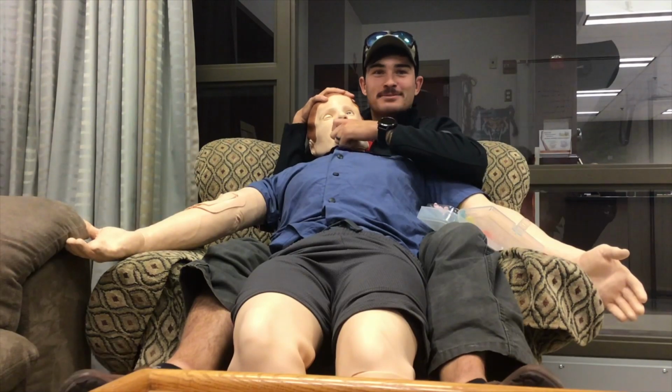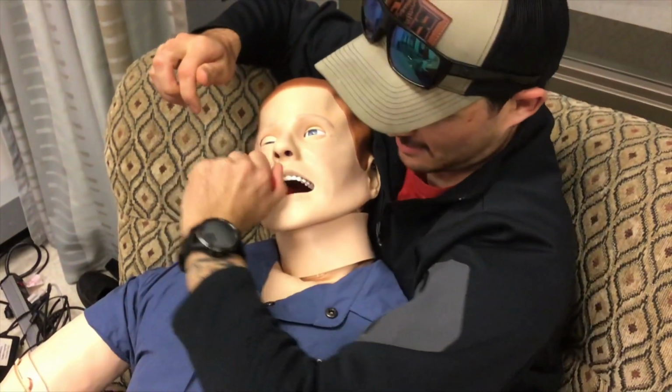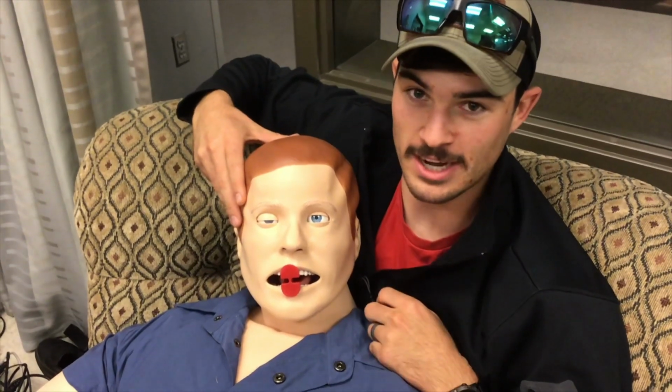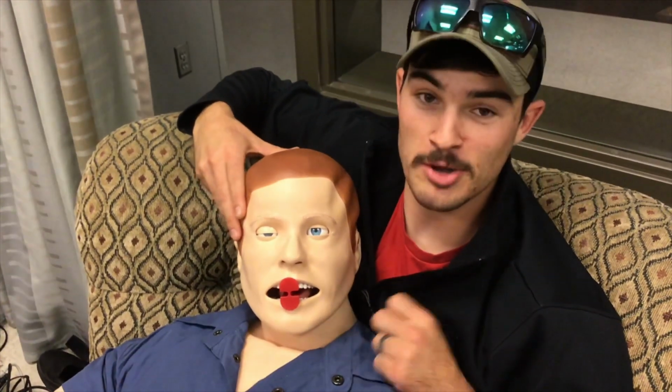Don't put an OPA in this way either. Inserting it, rotating it down, grabbing the tongue forward. There you go. If your patient aspirates, obviously take it out. We're going to need a suction. They have a gag reflex, which is a contraindication. That's all you need to know about OPAs.